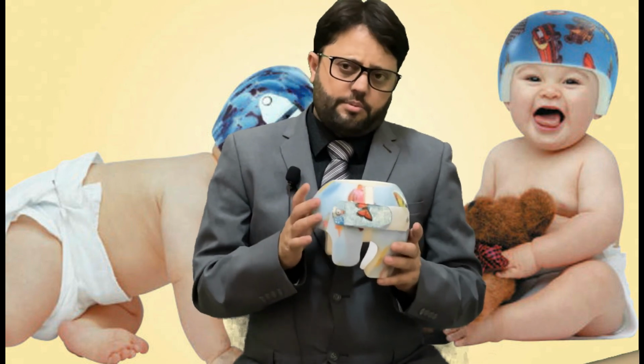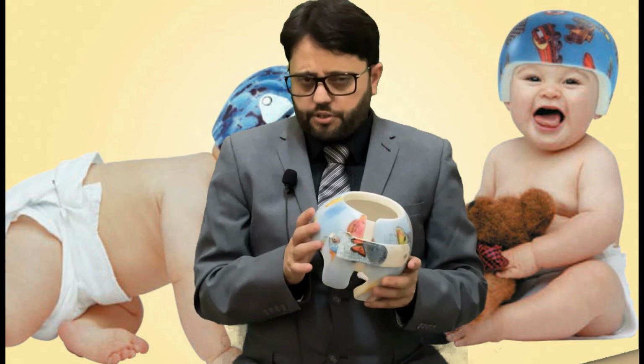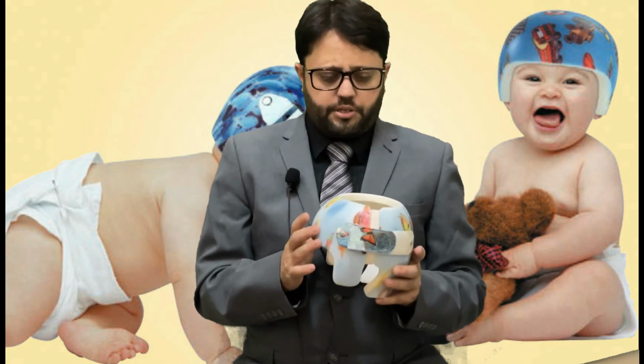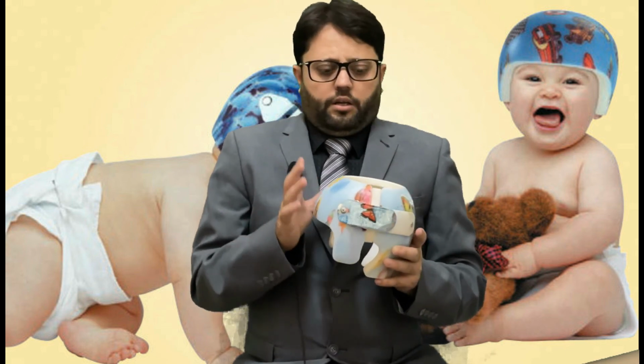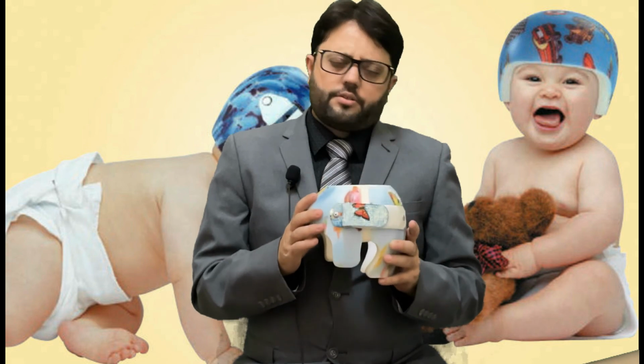This journey is a little bit long. It can take from 3 months to 4 months, even 5 months. In post-surgical cases, even 6 months to 9 months. And in some cases, we need to remake this at least twice. But the outcome, the results, are amazing.